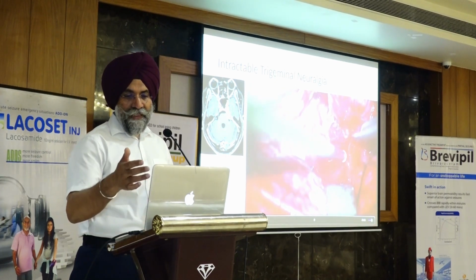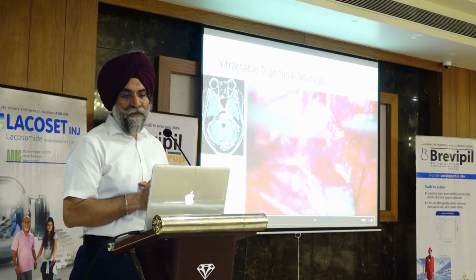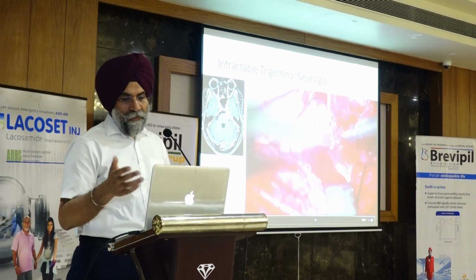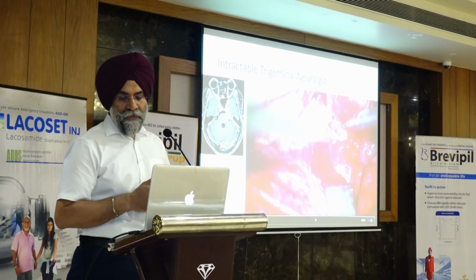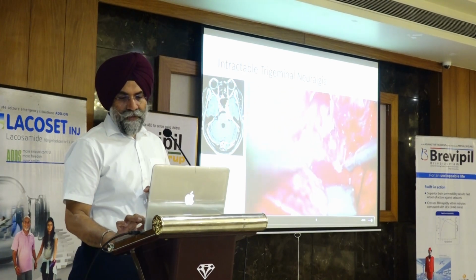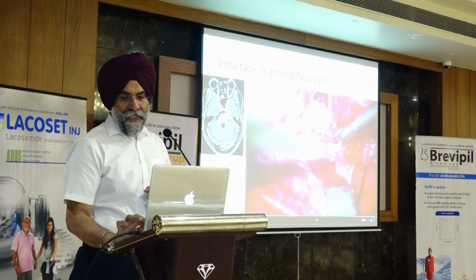Mind it that this is a post-radiation case. Many times you feel that once the radiation is given, the tumor becomes difficult to dissect and all that. So probably this is not the case. This whole tumor will come as a single piece. Just opening it up. This is the tumor in the Meckel's cave.